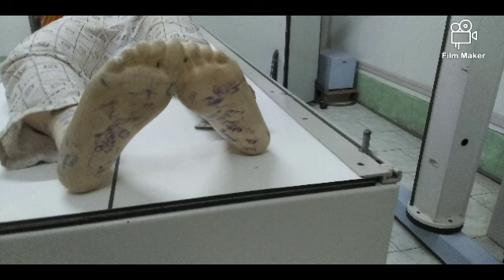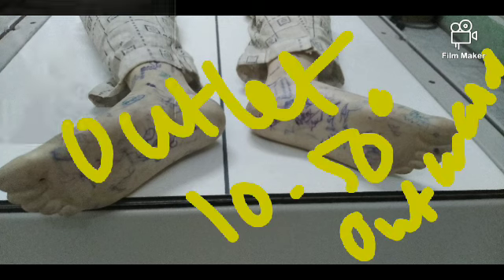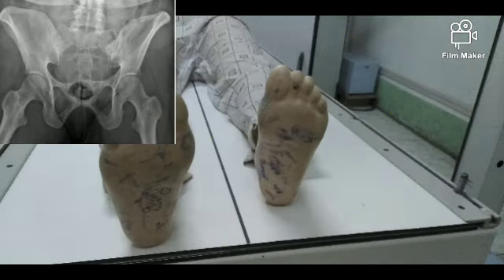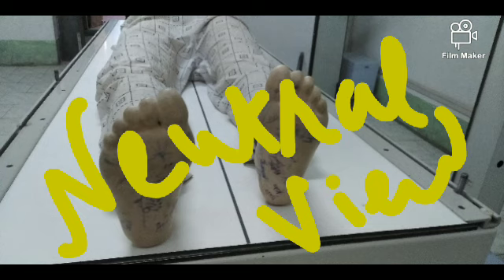Next thing is you have to decide whether you are going to take inlet view, so the feet will be turned 15-degree medially like this in the image. If you want to take outlet view, your feet will be placed outward, and this is the position for neutral view, where both the legs will be kept together without any kind of rotation.